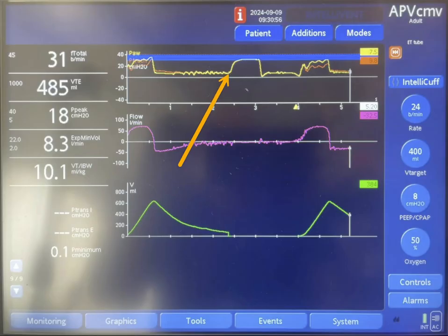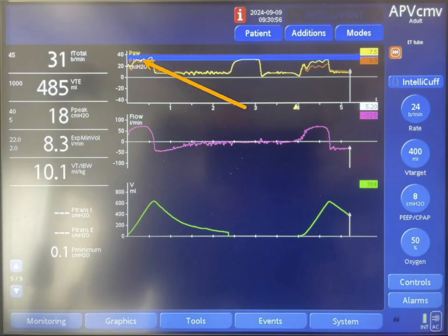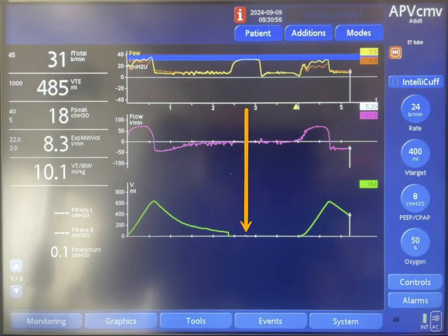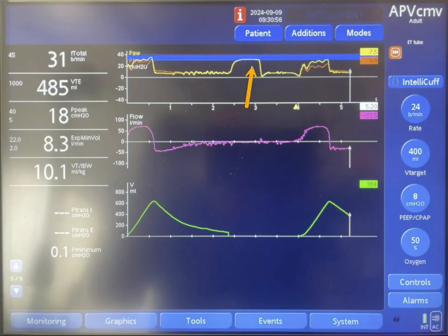Once the machine is triggered, a pressure of 30 centimeters of water is delivered for the duration of inspiration. Notice that with this pressure of 30 centimeters — similar to the previous breath — there is no flow at all. There is no volume either. The flow stays at zero for the duration of inspiration. So this is a machine-delivered breath, but with no flow and no volume. It looks like the airways were obstructed completely.